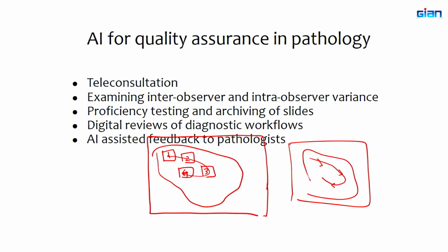So, it can help in digital reviews of diagnostic workflows. And through this, you can also provide feedback to pathologists. Remember, for the eye gaze analysis that we saw yesterday, one of the applications that we discussed was teaching, right? If you can train a model to understand the eye gaze of specialists, you can in theory use that to teach a junior pathologist or a junior radiologist.